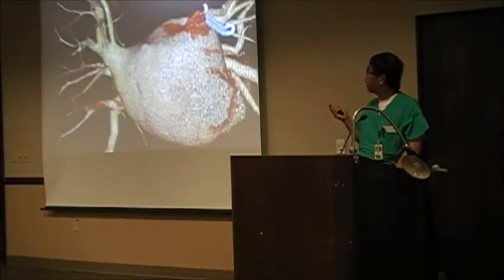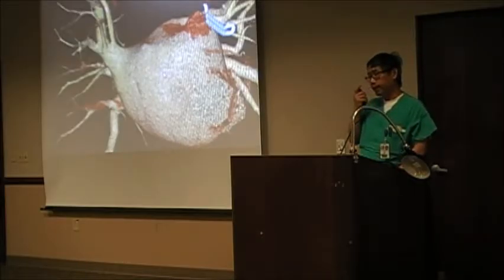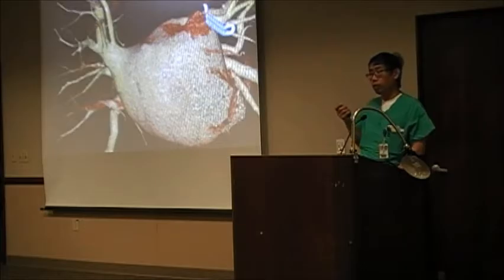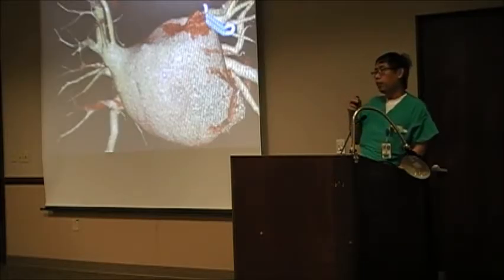This is my case. This patient has atrial fibrillation. He took Coumadin, therapeutic at 2 to 3, but he had a huge brain bleed, almost disabled and died, and stayed in the hospital for 3 months. When he finally recovered, I saw him and said, neurology will never let you take Coumadin anymore, and then you have a high risk for stroke again. How about this? Let's close the appendage, and after appendage closure we do ablation for you. Dr. Brother first put the AtriClip on the appendage, and 4 weeks later we brought him in and did the convergent maze procedure.